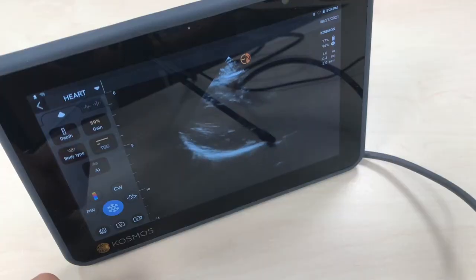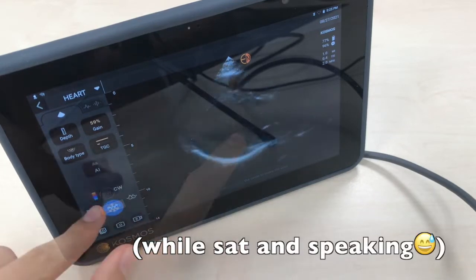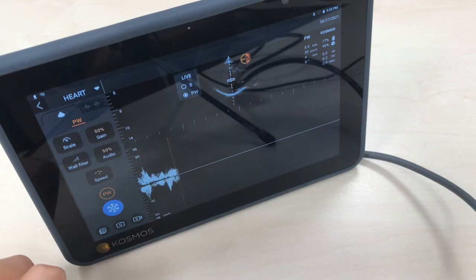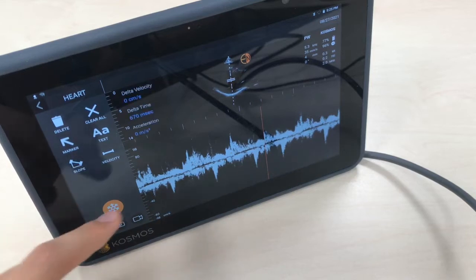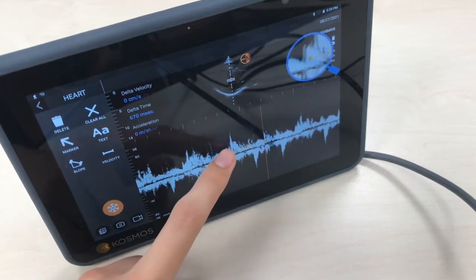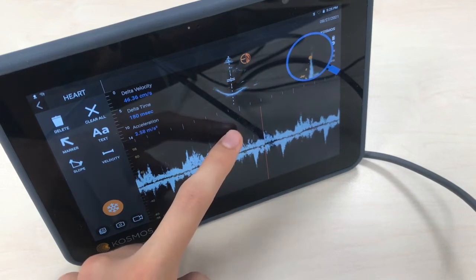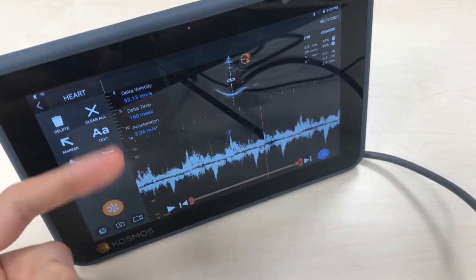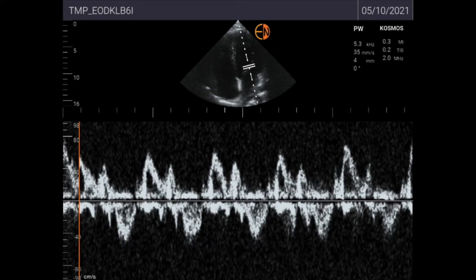I will also show you the pulse wave Doppler and continuous wave Doppler with this view, since it's the only one I can obtain on myself. If you pause the image you can measure the slope. You can see in the upper right corner where you're pointing exactly, and here you can see velocity and acceleration.